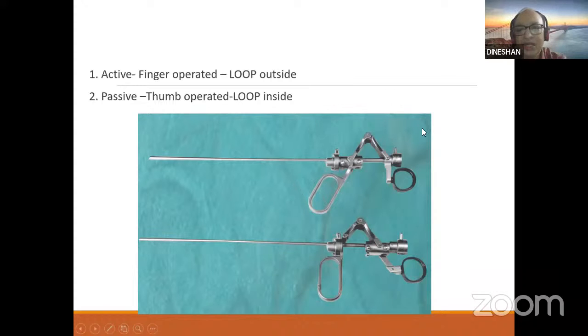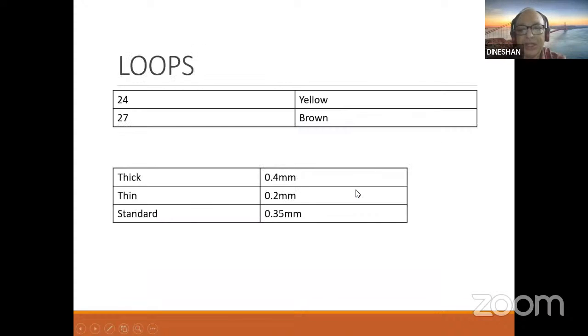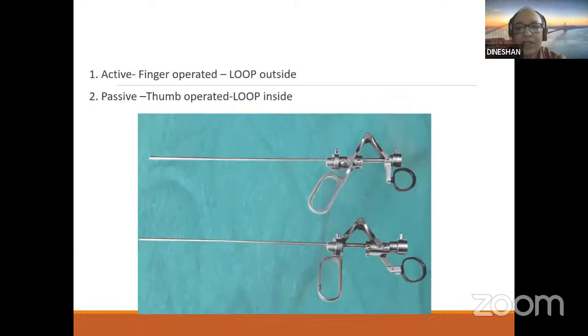The disadvantage of an active, finger operated working element, is that if you accidentally activate the diathermy with the resectoscope inside, you may injure the bladder, because the loop is always outside. But it is said that technically it is a faster one, but it depends on how you are using it and what you are used to. They don't make much of a difference.